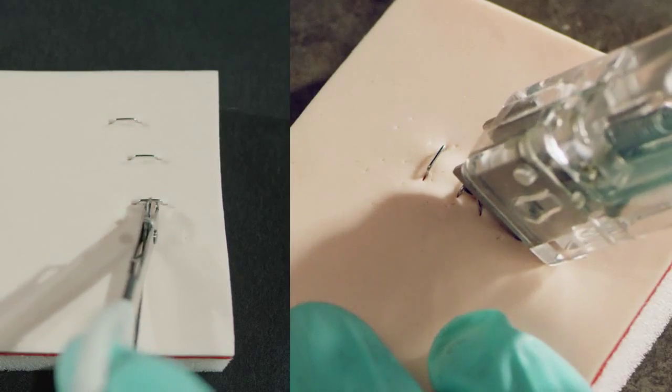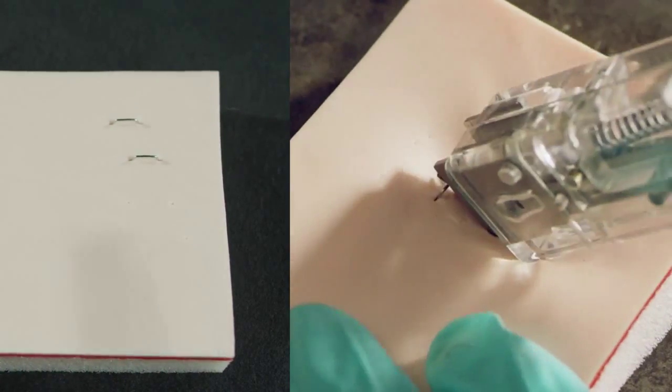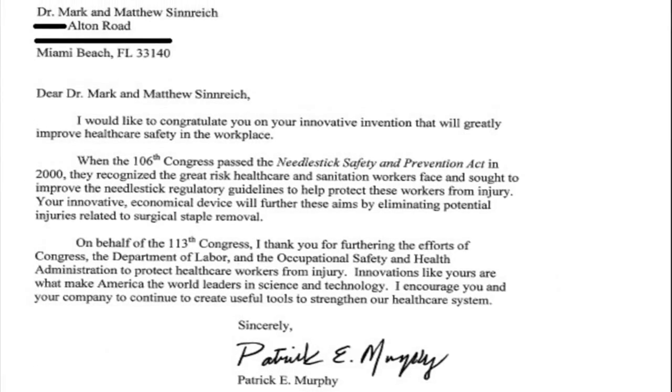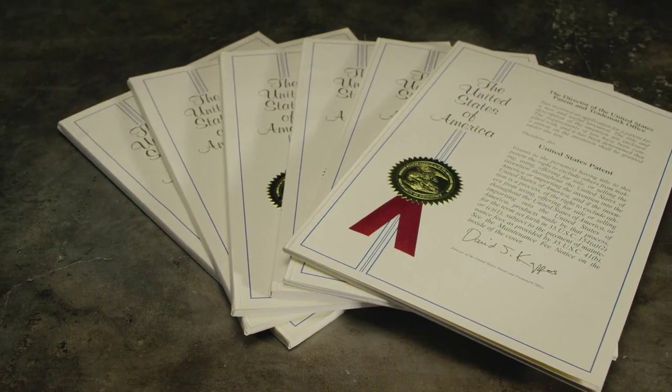Now take a look at how we change staple removal. The SSR is almost 100 times faster and way less painful. And most importantly, it's safe — it's so safe, we got this awesome letter from Congress, the United States Congress. We've also been issued seven patents, so the technology is protected.